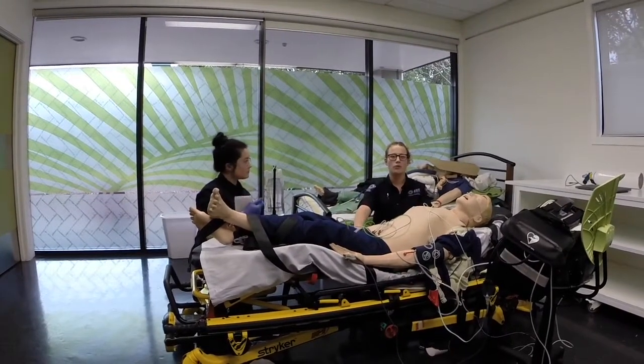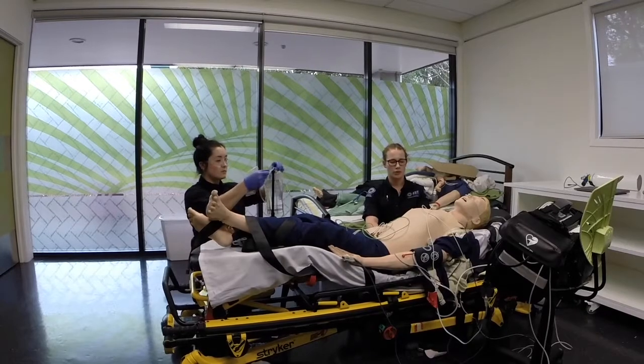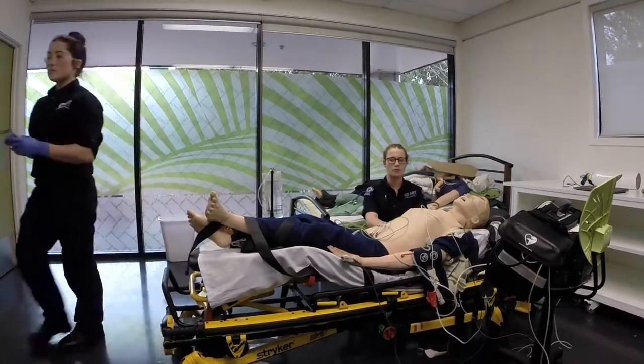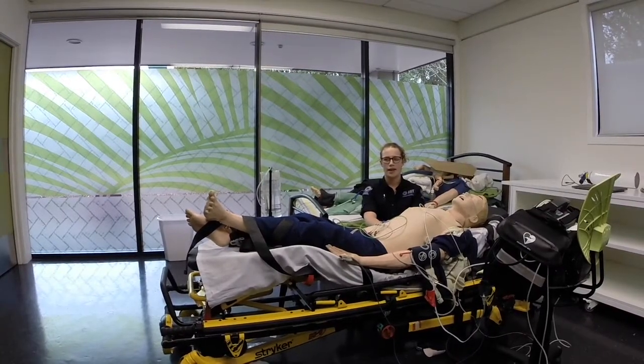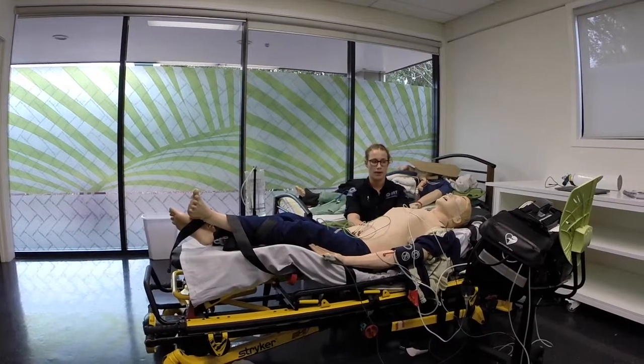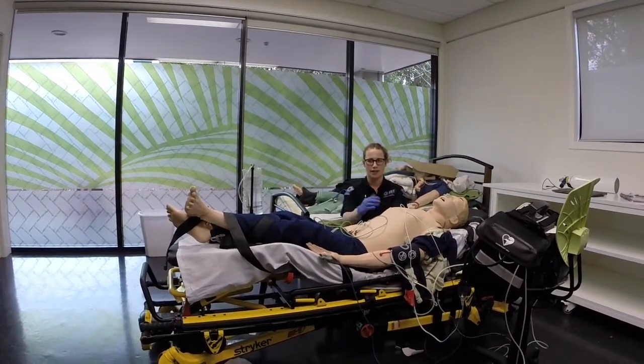However, if he did not revert, we would be able to shock once more, because there's a maximum of 2 times that you can shock them. Otherwise, we would also seriously need to head in the direction of our backup so that the ICP can chemically revert.